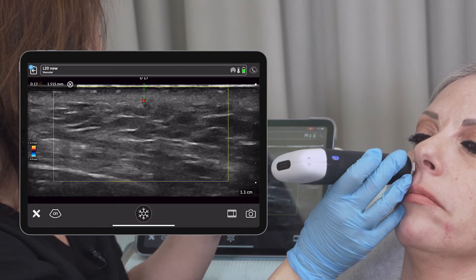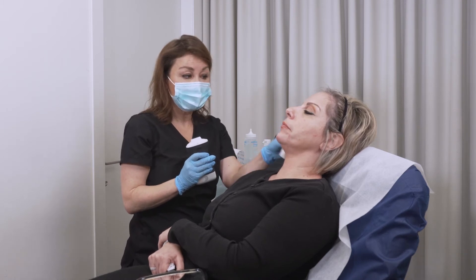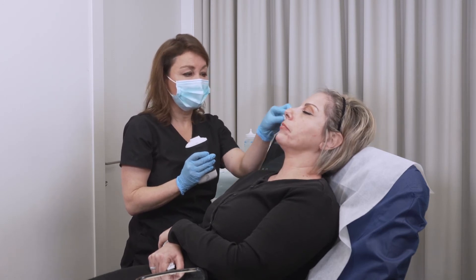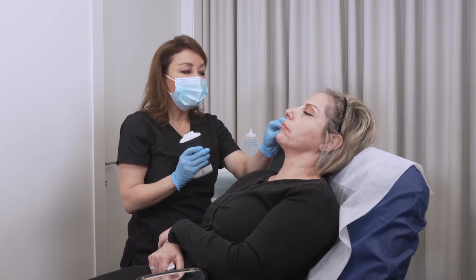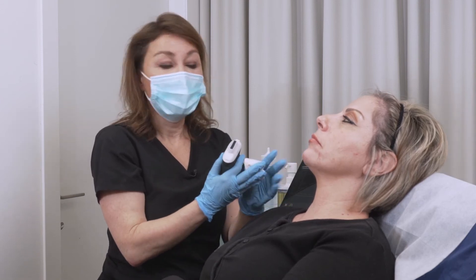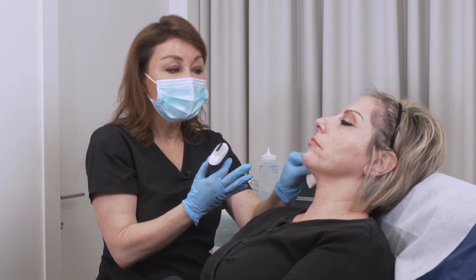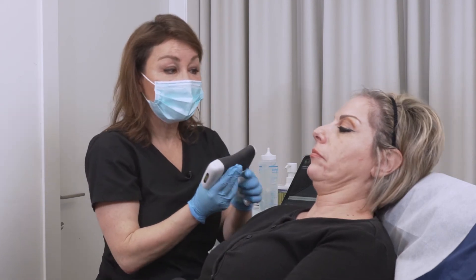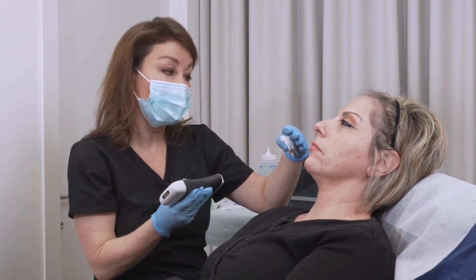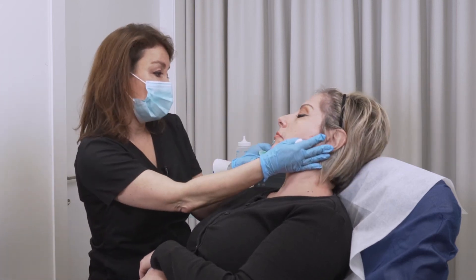It's at 1.5 millimeters depth. So what we can do is inject the lateral sides of her cheek without any risk, because this is not a danger zone — it's a very safe area. But if we want to inject the front side of her cheek, we need to check where the infraorbital artery is. Another artery, a little more medial, is the angular artery, which we also need to check if we want to go closer to the nose.